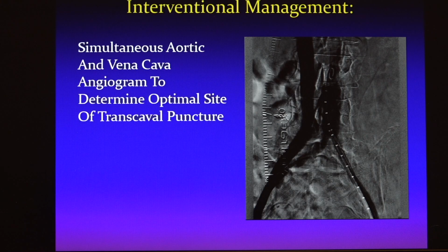Through the vein, we go with a system with a Confianza Pro 12 wire. We cut the tip of it, 1 millimeter, and we put it in a .014 catheter, and we put that in a .035 catheter, and all of this system goes through a short renal Lima guide. Then we let this Lima guide face the opening of the snare, and we confirm the positions at 90 degree angles.